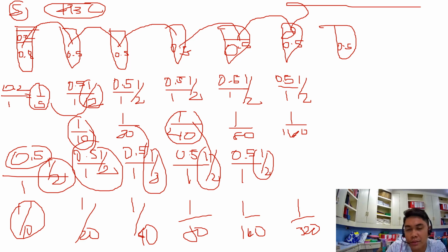For test tube number 7, no dilution, because this is a negative control. The components of your negative control are your NSS and your RBC suspension. No serum. So that's for the cold agglutinin test.